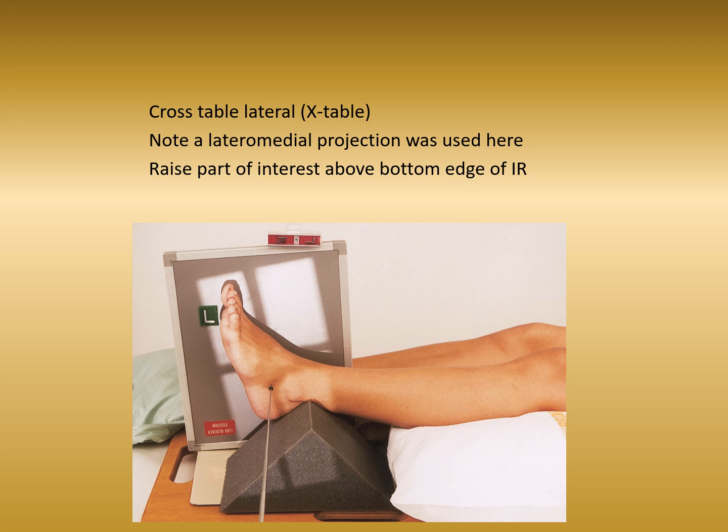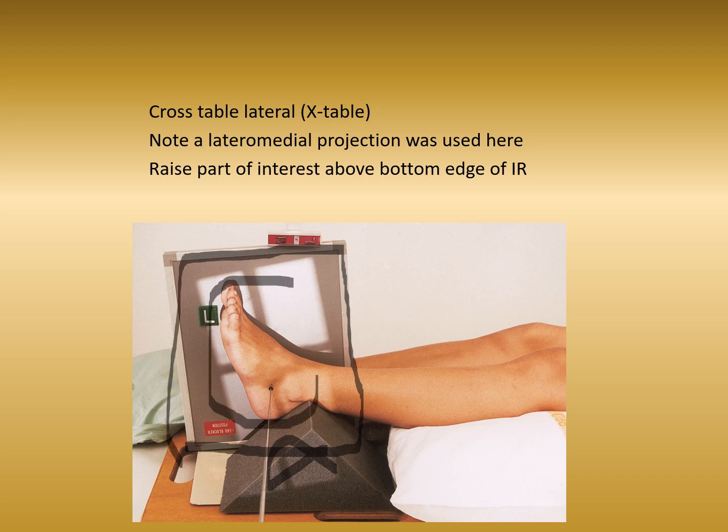So what's important to notice here on this picture is that they've raised the foot on this sponge, all right? The reason for that is because we need to make sure that we do not clip the bottom of the foot off of the IR. So we're going to raise the part of interest higher than the bottom edge of the IR.